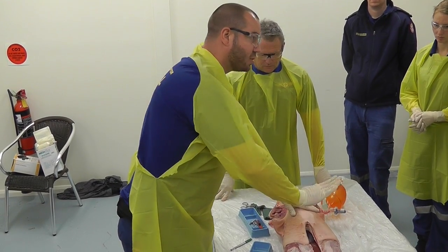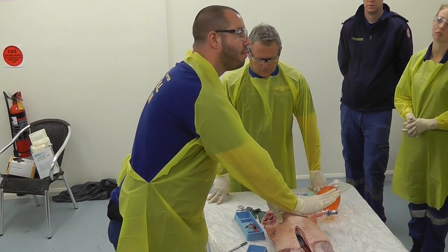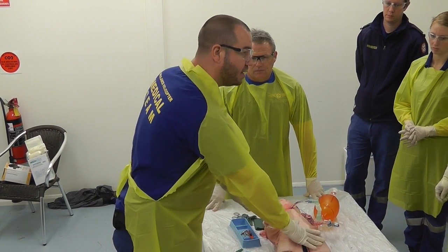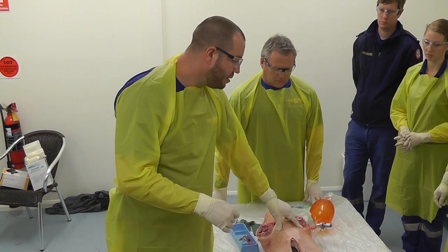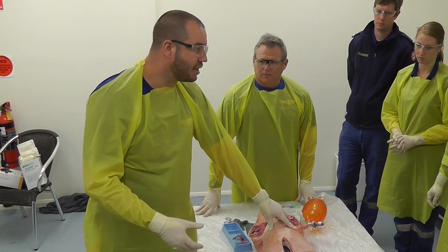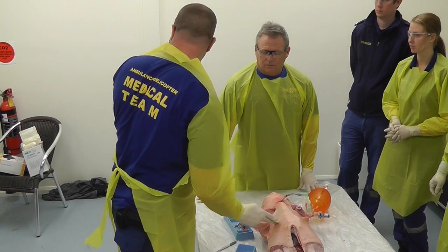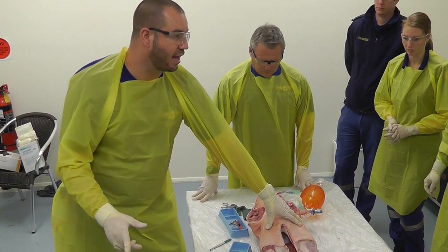Tell them: put your hand palm down inside, underneath the lung, round until you feel a squidgy thing — push that squidgy thing against the vertebral column and stay there. If they start to fibrillate, externally defibrillate the chest. People talk about flicking the heart — it may or may not work. If they get ROSC, have your drugs ready to anaesthetise them and give some muscle relaxant. You will see blood coming out of the internal mammary arteries — clamp those off. Then think about how you are going to get that person to the nearest cardiothoracic centre.